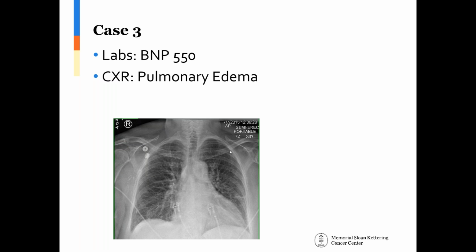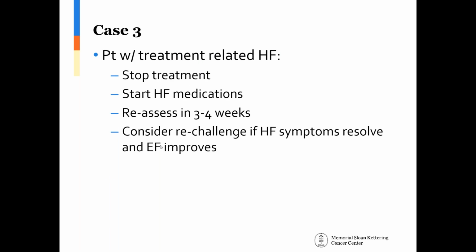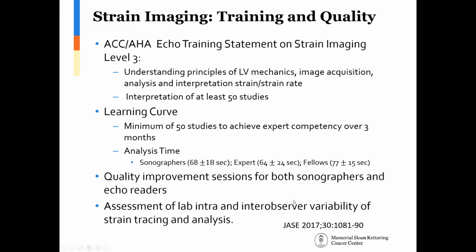adequate. And maybe, if you want, this is Vlad, I just wanted to add one thing, summing up the concepts that Jennifer and Dinesh have presented here. The experience from Dallas, a National Cancer Institute site, where at this point we have an embedded echo lab within the cancer center. So it makes communication easier with the oncologists. We have trained sonographers in the lab, and that's what they do. It's all strain-based echo. And we have stations that are confirming.